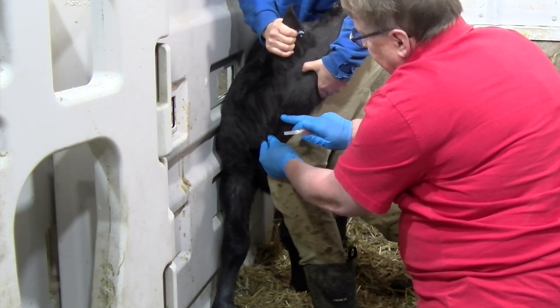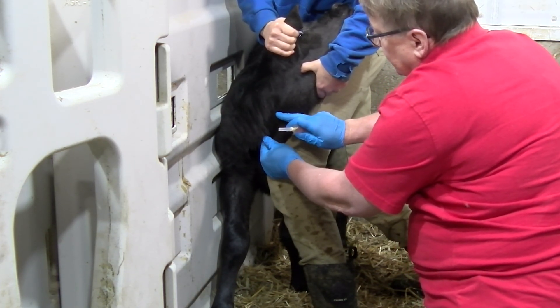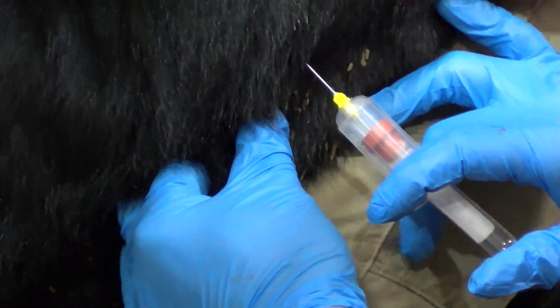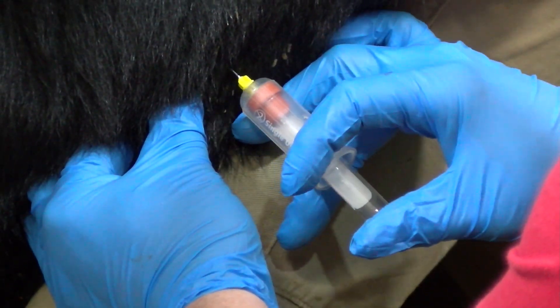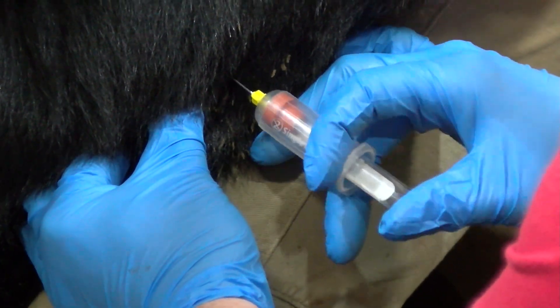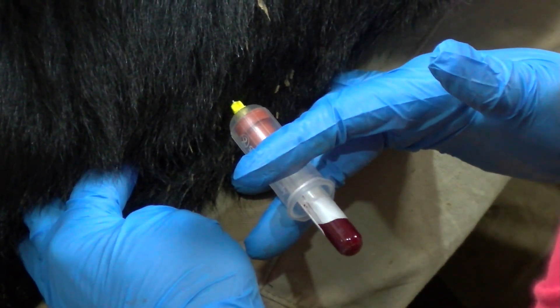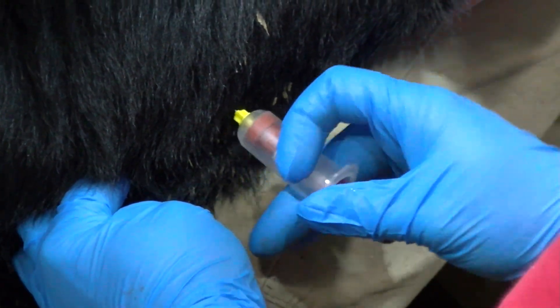Start by blocking the vein at the base of the jugular furrow, allowing it to fill with blood. Insert your needle at a 45 degree angle and attach the blood collecting tube. Once you have obtained the necessary amount of blood, remove the blood tube from the needle and then remove the needle from the vein. Use a finger to apply slight pressure on the injection site to help stop any blood flow.